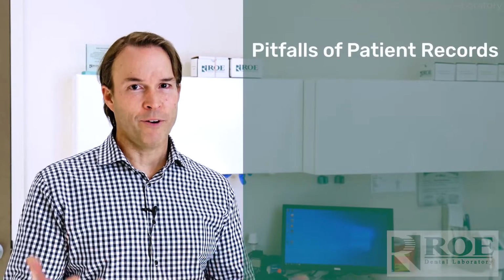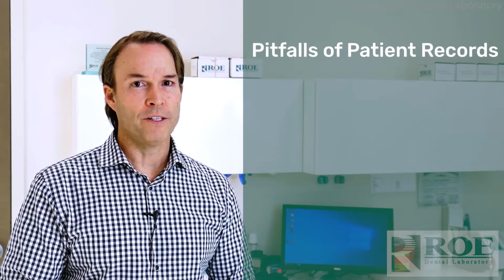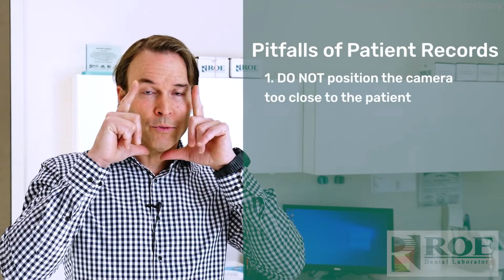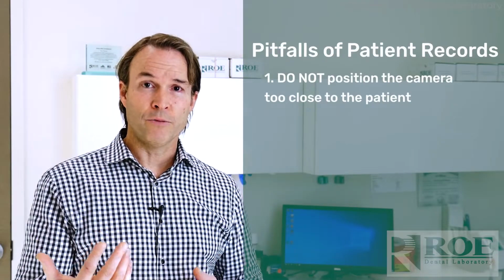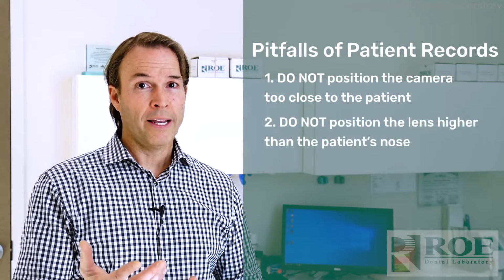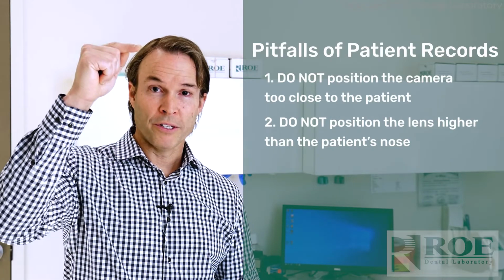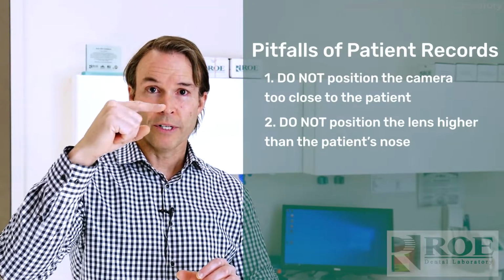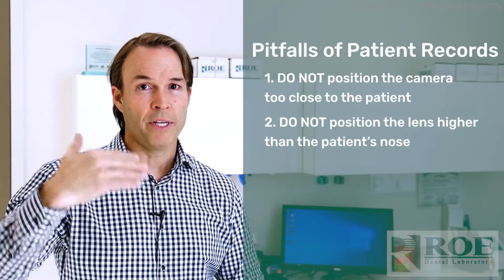We see many photographs at the laboratory, and there are always some little things that go on during these full face, full smile pictures. Often the camera is too close, and we have it bracketed just with the face, as opposed to the full head, because we want to make a nice smile simulation that we can present to the patient. Another common one is that we're using a cell phone, and the cell phone's lens is right up at the top of the phone, but often the camera is positioned a little bit too high. So just be aware of where the lens is on the camera and position that at the level of the nose, and that way we can see the plane of occlusion. That's why you want the camera at the nose. We can see the AP.